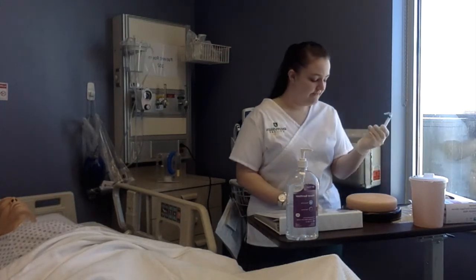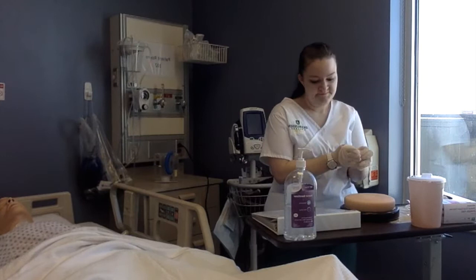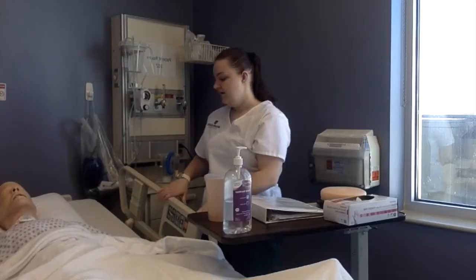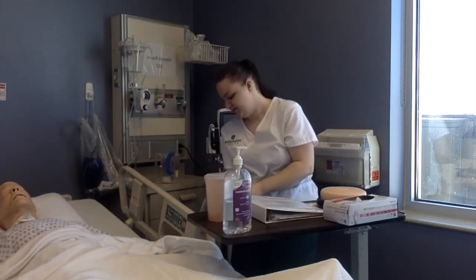I would not recap, I would use the safety. And I'd move these into the sharps container. I would then take off my gloves, throw them in the trash. Alright, after my injection is complete, I will perform hand hygiene. I will move the bed into low position.